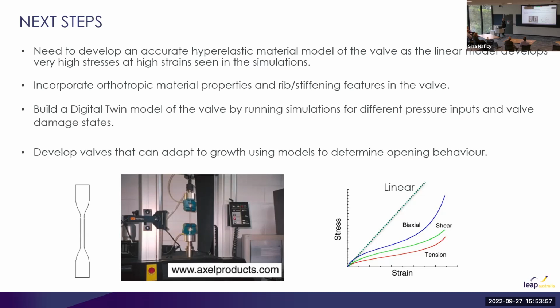Next stage then after that is building a digital twin, which I won't talk about. I'm not going to step on feet. And then there's also some work on developing valves that can adapt to growth using models that determine the opening behavior. So as the valves get bigger, we want the same valve to be able to work without having to keep replacing the valve, which is an unpleasant process, I'm told.